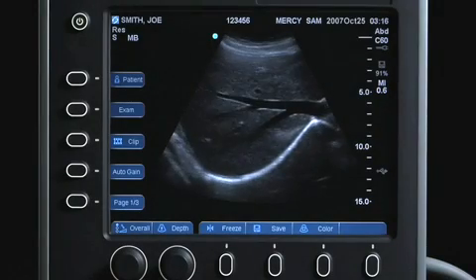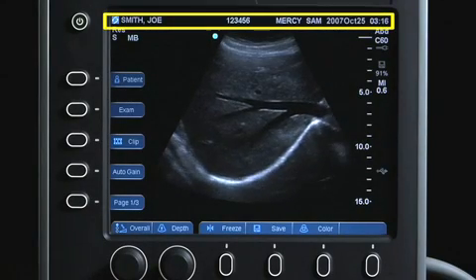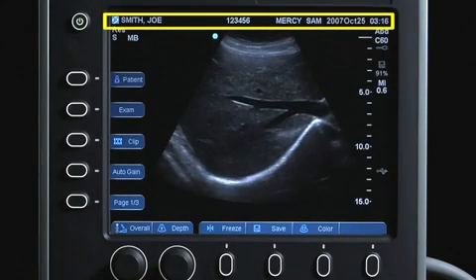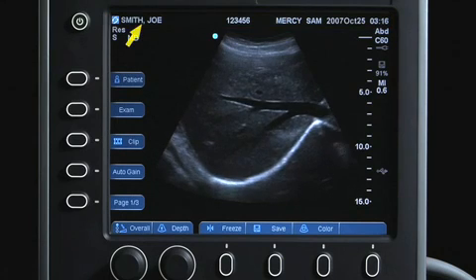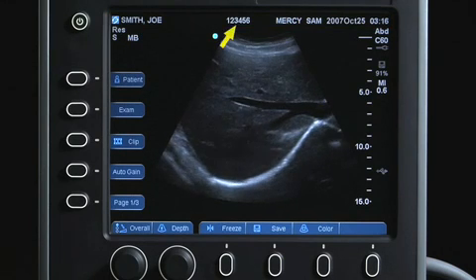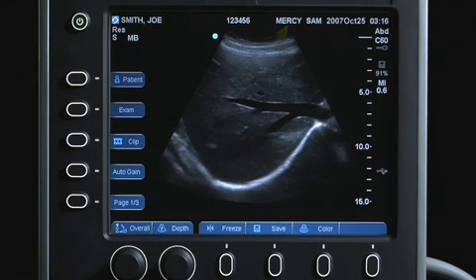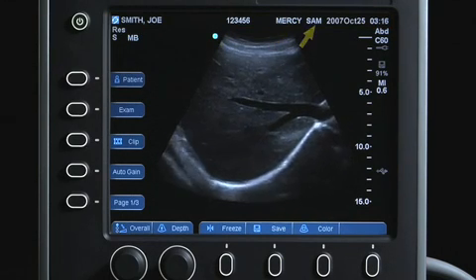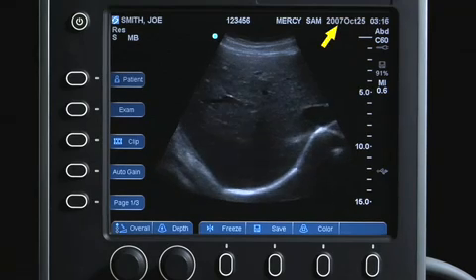The screen layout includes the patient header at the top of the screen, which displays the current patient name, ID number, institution, sonographer, and date and time of the study.